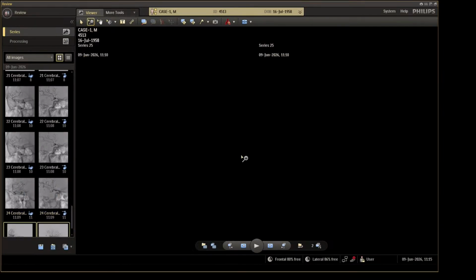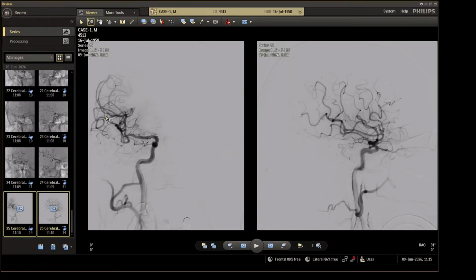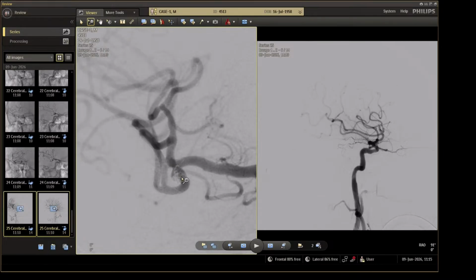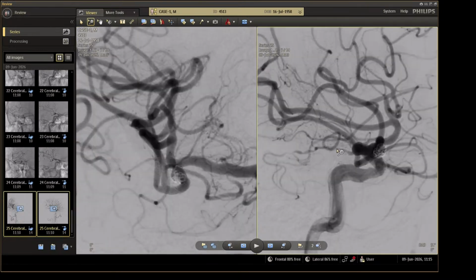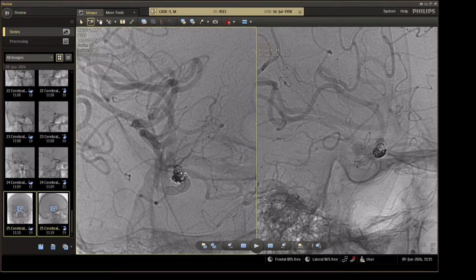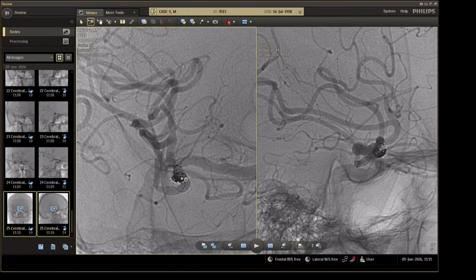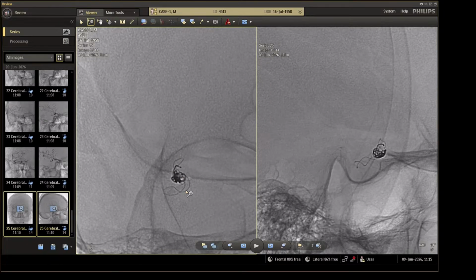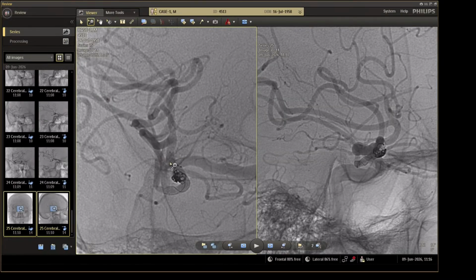And now, as usual, as a protocol, this was the last angio till now. A small part is filling, but with the stent and the coil, this part will be occluded on the follow-up. Usually follow-up MR in 3 months and the angiography in 1 year. We will see. It shouldn't cause any problem. There is place for one more coil, but I'm not sure we should treat the picture. For the aneurysm, this part is occluded. This part will be occluded with this stent, and this part of the stent is open.